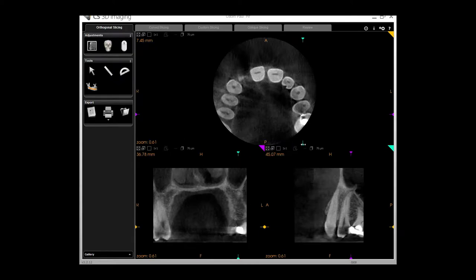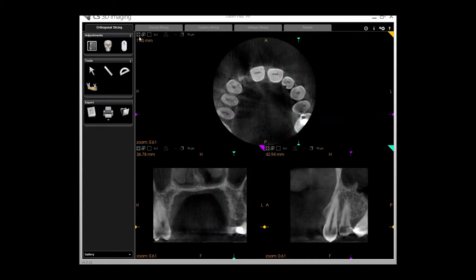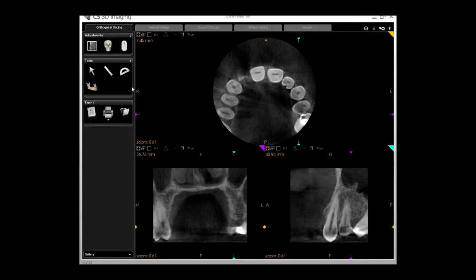The MPR slicing tab will give you the opportunity to look through in the truest possible nature and to establish an understanding of the SES scan system, which is a tab-based system. To move the images around, you lift tabs which I'll show you in a second. You can also increase the thickness of the images, which is very good functionality. The tabs on the top part of the screen will show you different possible viewing options, and the tools are on the left part of the screen.